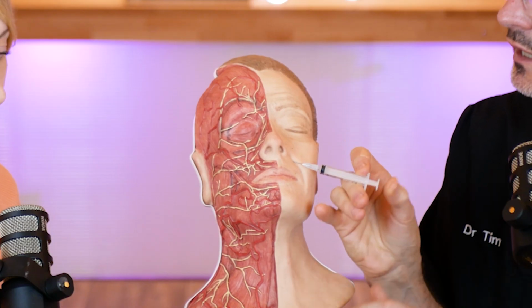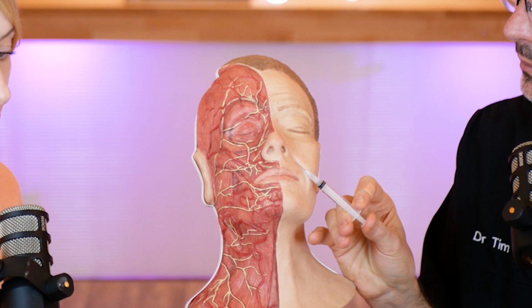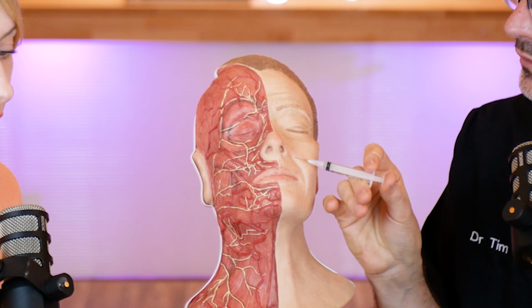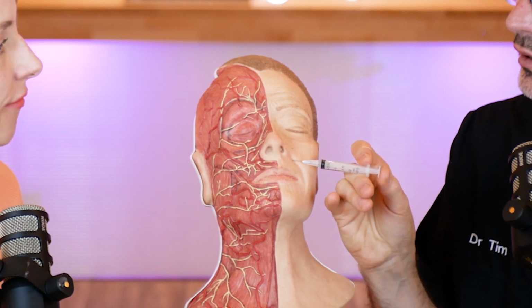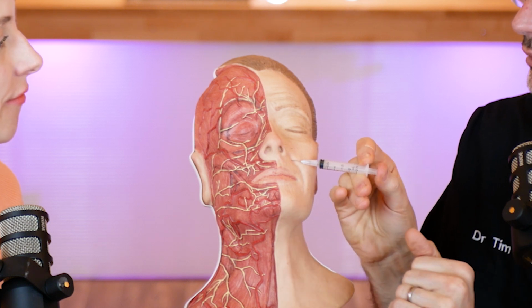Now, that doesn't mean it has zero value, because something else people say is, well, it only works with the first injection. Well, that's often where we put most products. So if I aspirate at the alar base, come out all the way to just underneath the dermis, and then do a bit more, which I could always aspirate again for, and often I would, that doesn't mean the first aspiration didn't help. So we're reducing risk, but only so long as after the aspiration we're completely stable, and then you do your injection.